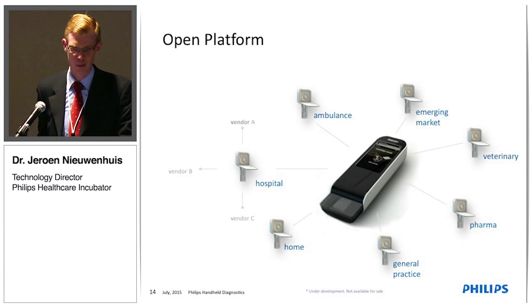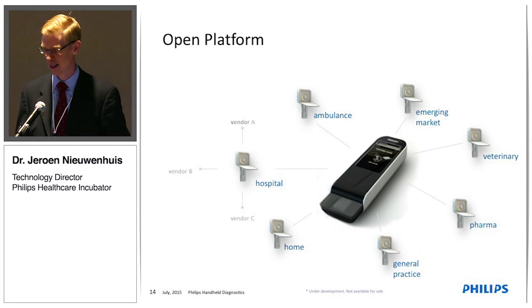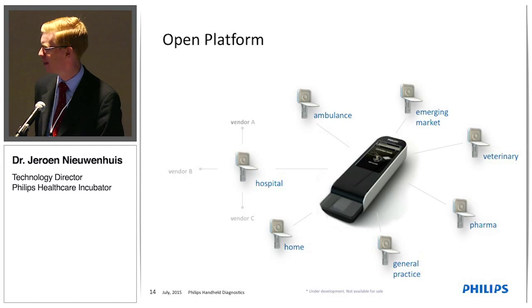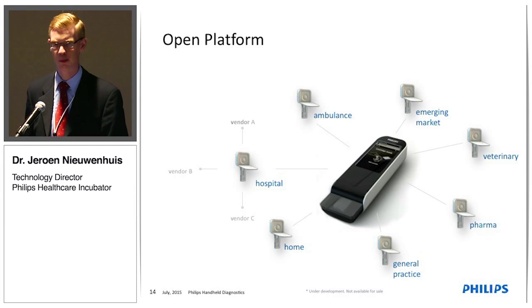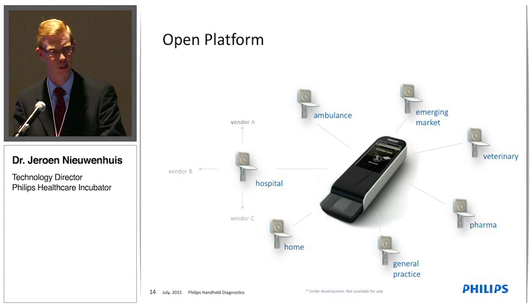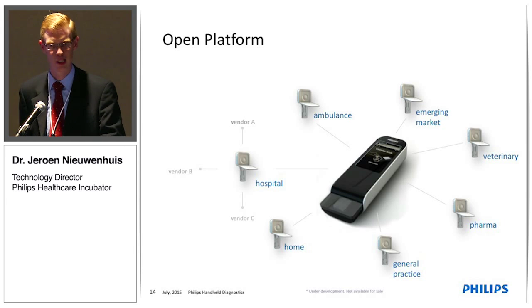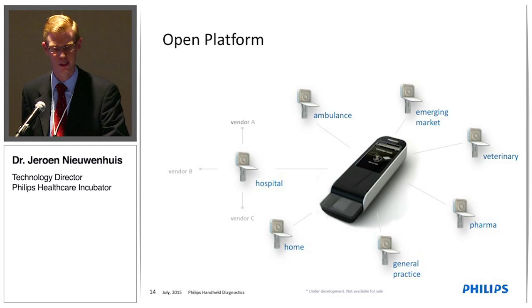Then looking at the way to get a large menu, I already mentioned it before, that if you develop such a system, in principle, if it's a quite universal immunodiagnostic system, there are many applications that can be made on the system, whereas one company typically has expertise in a certain area. It could be disease area or application area. And sometimes even within a certain application area, there could be different parties that have a deeper expertise in certain areas, for example, oncology, cardiology, infectious disease.